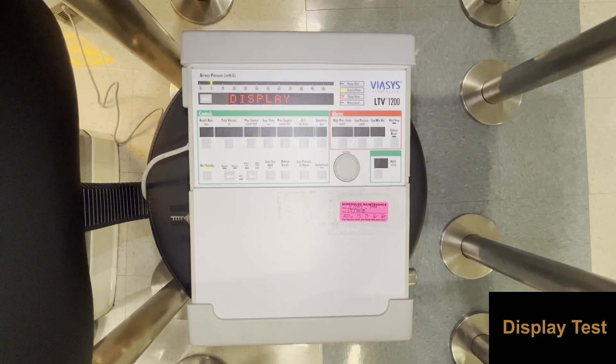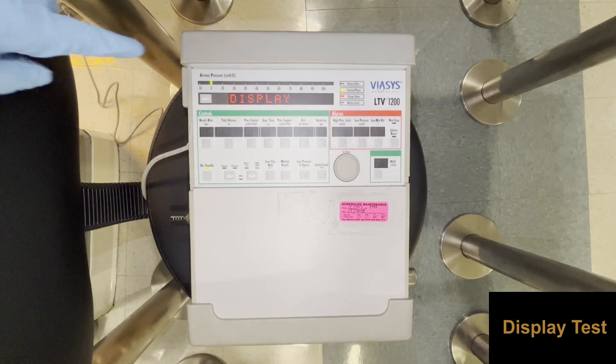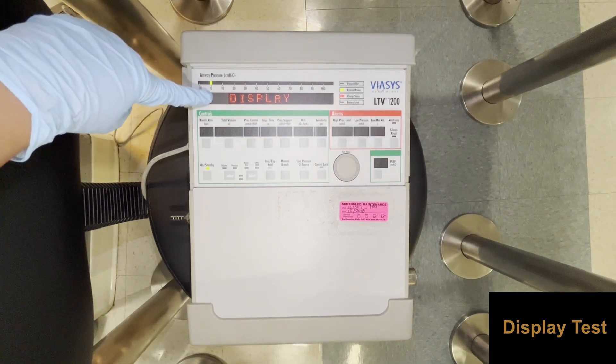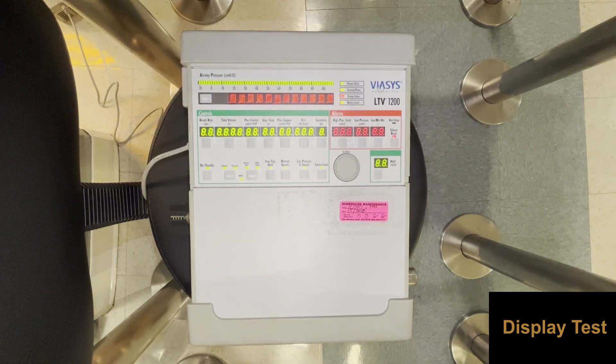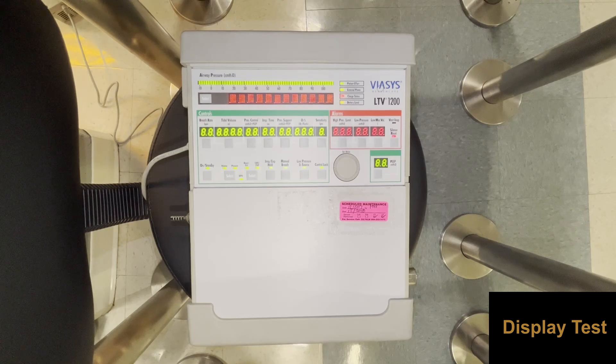To perform the display test, push select while display is shown on screen. All of the displays should light up, including the dot matrix, all LEDs, and the seven segment control displays.